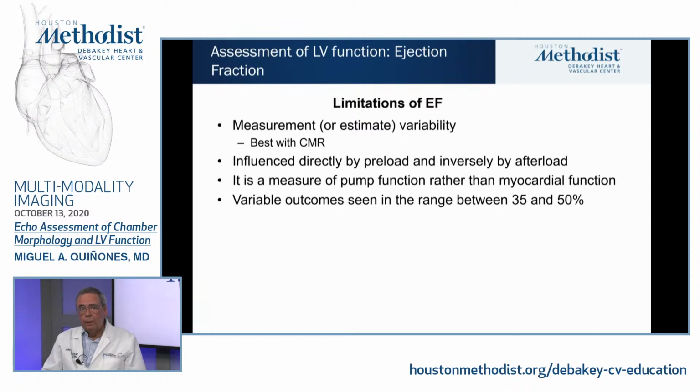Now, it's a measurement of the pump function of the heart. The heart pumping. Not a measurement of the myocardial function. And perhaps because of this, we have seen variable outcomes in a range of EF.